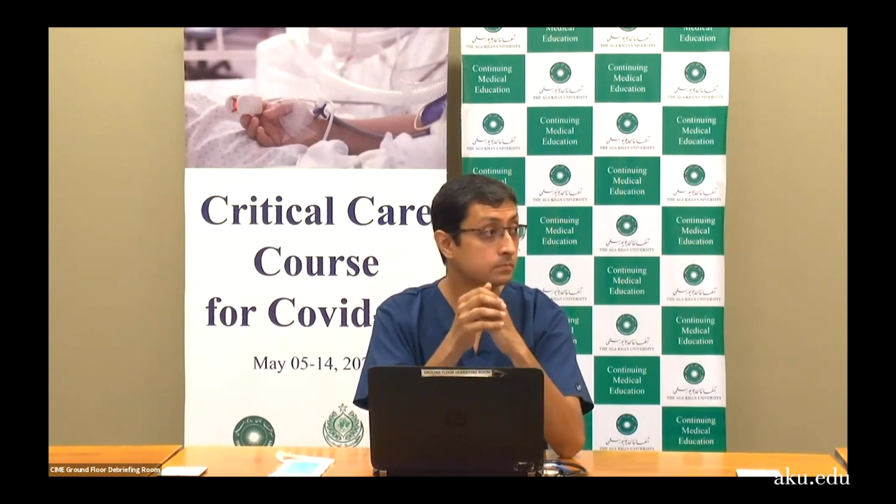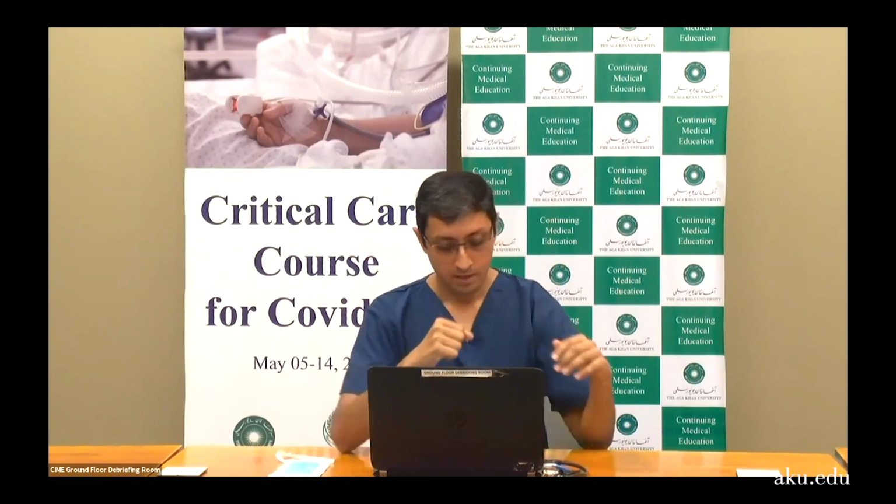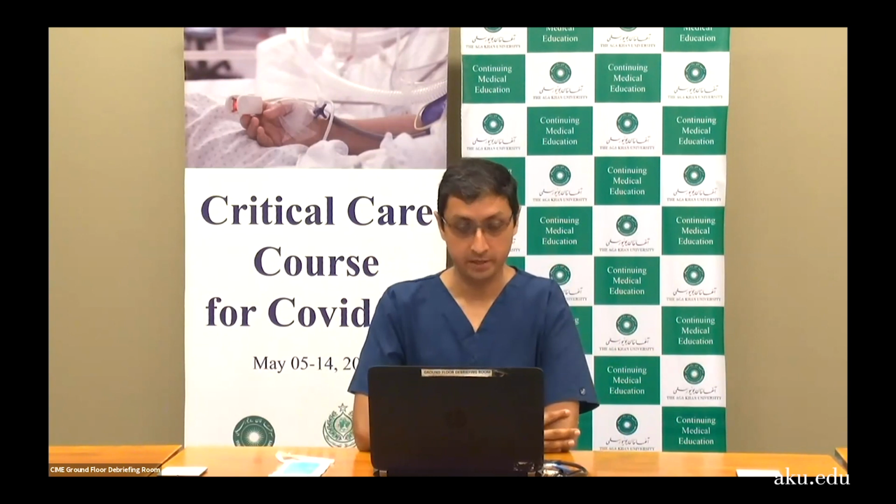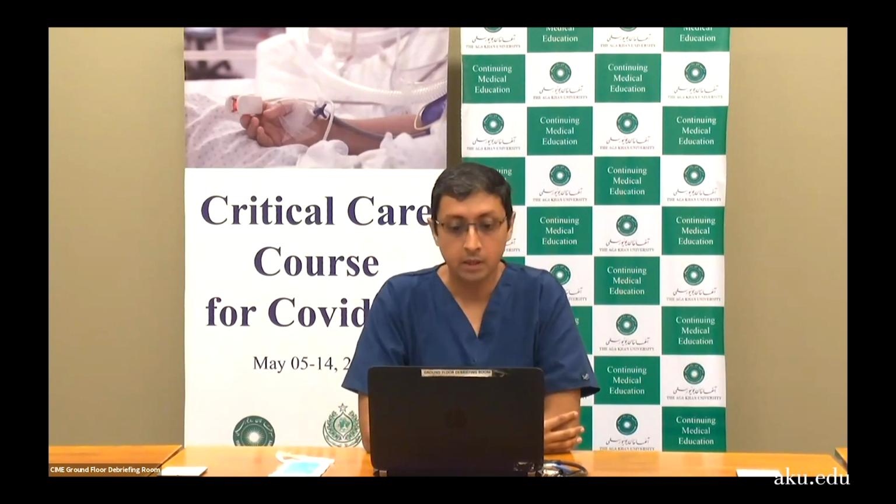Hope the query will be cleared. One of the questions, a lot of videos were also coming on social media: can we ventilate many patients with one ventilator? What is your thought? My thought process is that it is not recommended at all.